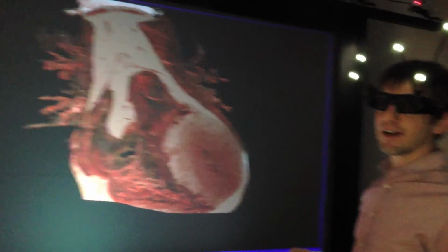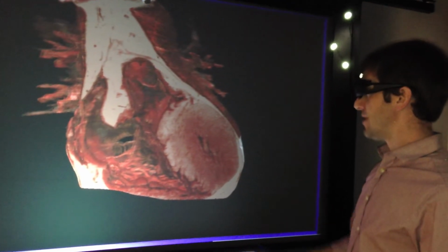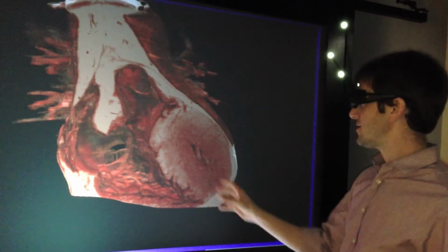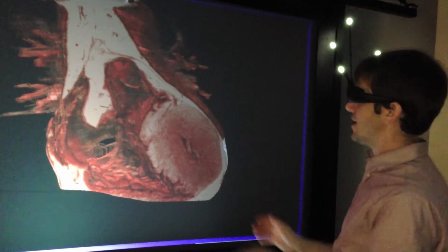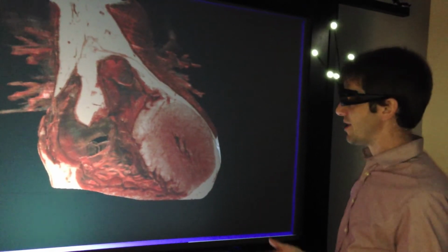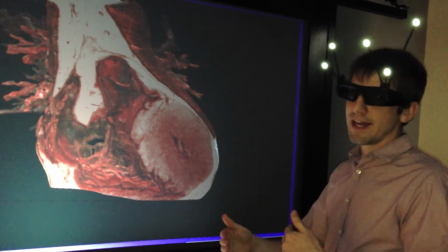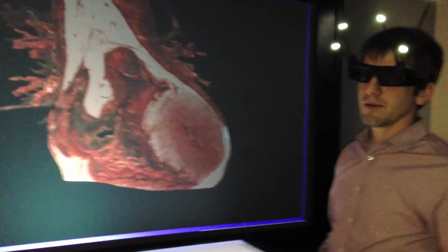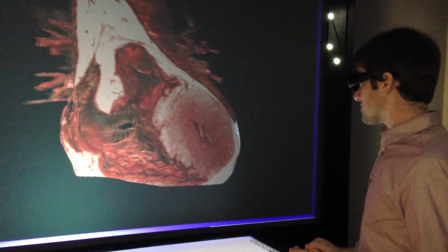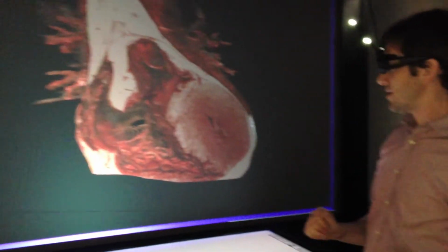If you've got a CAD file of your device, you can load it up under the program here and virtually fit it. So, if we have this curve, is it actually going to make it around to reach the valve at the appropriate angle? Or you can flip it and find that angle before designing your device, which would probably be the preferred approach. And this is much less expensive than doing a clinical trial.